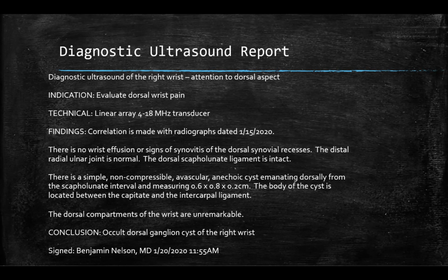So I've found that guiding a 22 gauge needle to the center of the cyst with a limited fenestration and injection, one can be, in many cases, curative if it is the pain generator, or two, it's a diagnostic test to understand whether this is truly the pain generator or there's another etiology to it.